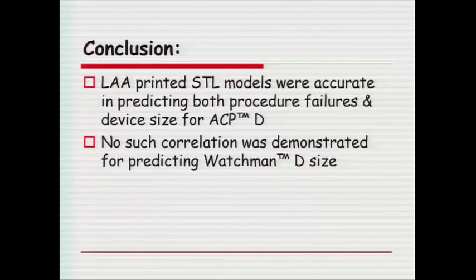And just to conclude, LAA printed STL models were accurate in predicting both procedural failure and device size for the Amplatzer devices, and no such correlation was demonstrated for predicting Watchman device size.